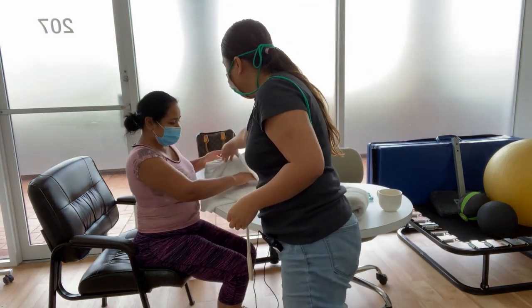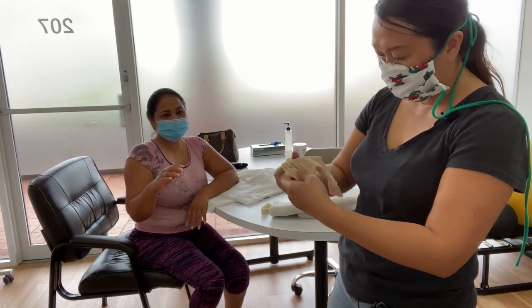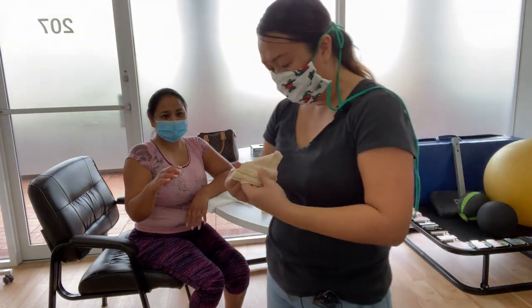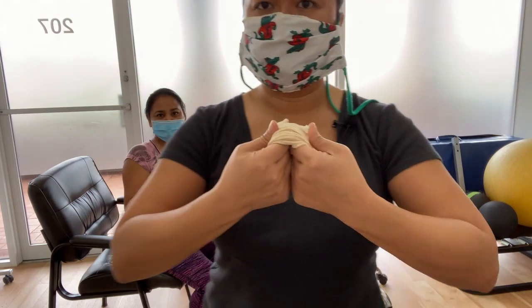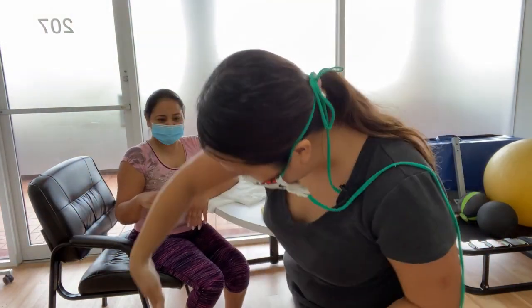So let's take this off. It's always about gravity, right? So come on and stand up. I'm going to put my fingers in and I'll pull it out. So come on in — you're going to put it in like this.